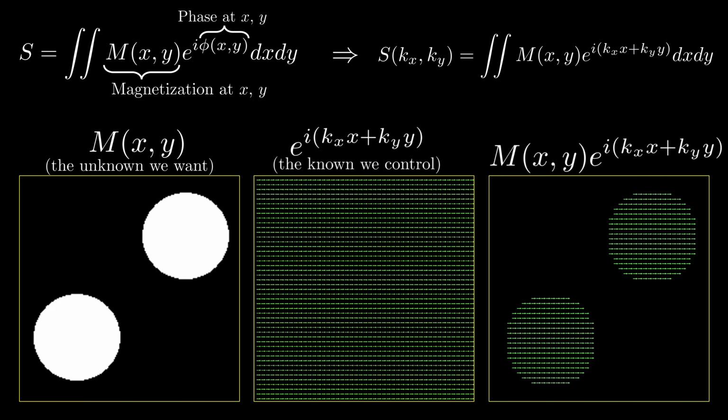As a really quick side note though, we're keeping our discussion simple today by assuming that all spins are excited into the transverse plane perfectly along the real axis of the rotating frame. So m sub xy is entirely real and can be represented as a simple brightness map. But note that in general, m sub xy is complex. Excitation may not perfectly excite spins all with the exact same phase like we're showing here. Possible reasons for imperfect excitation can include B0 or B1 inhomogeneity, motion of spins during the experiment, chemical shift or off-resonance effects, and a whole host of other things.